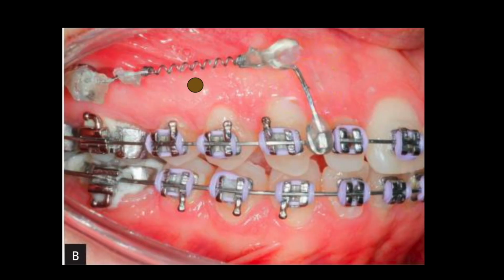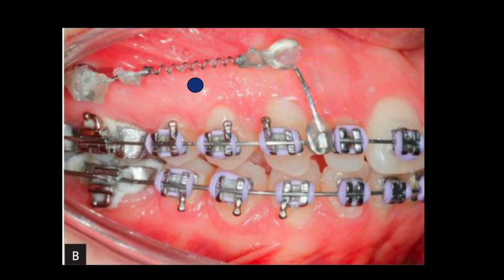Step number 2, identify the center of resistance of the active unit. The center of resistance in this case is of the total arch, so we have the center of resistance like this in the picture. Step number 3, determine the force vector from the miniscrew. There is a coil spring. It comes from a hook to the miniscrew, so it creates the line of action of the force like this.